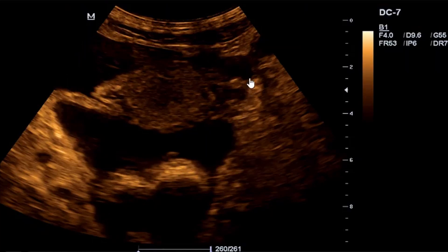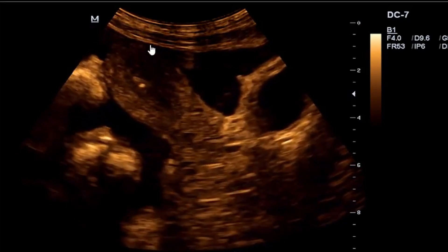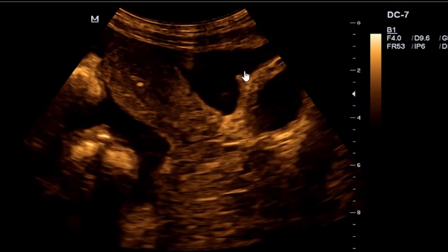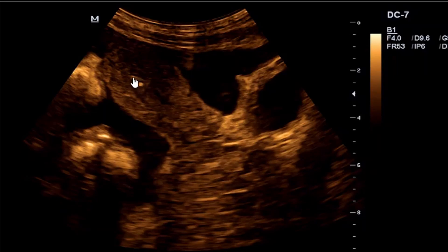Our uterus here is floating in this free fluid. Again, in longitudinal section, you can see here is our uterus, and you can see this anechoic free fluid here. We have our bowels here, and what we are seeing here is our urinary bladder. Inside the uterus, we are seeing these internal echogenic particles.